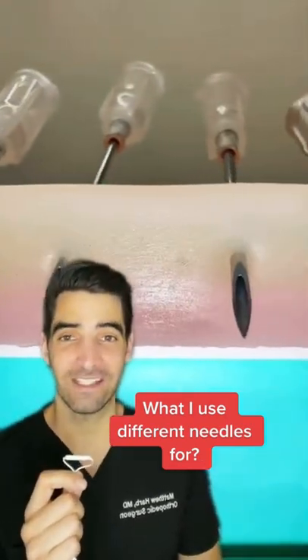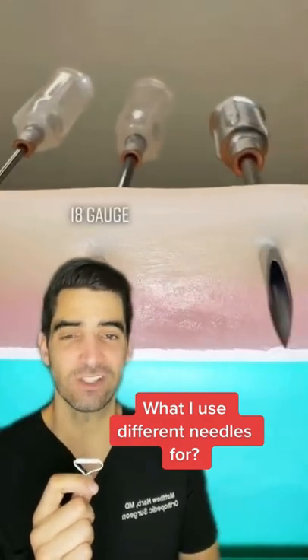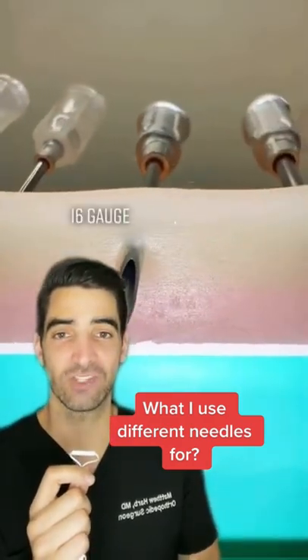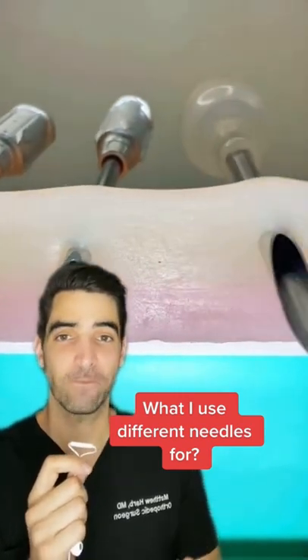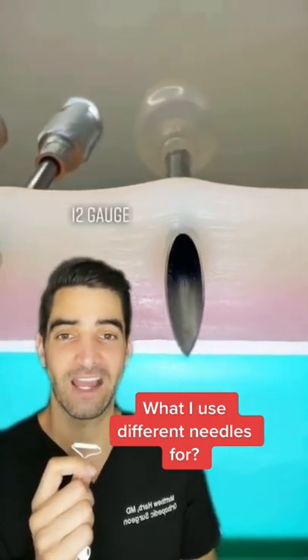20 gauge is a good IV needle. An 18 gauge needle I inject a knee with a viscous gel fluid. 16 gauge is good for massive transfusions, and 14 and 12 gauge are good for intraosseous infusions.